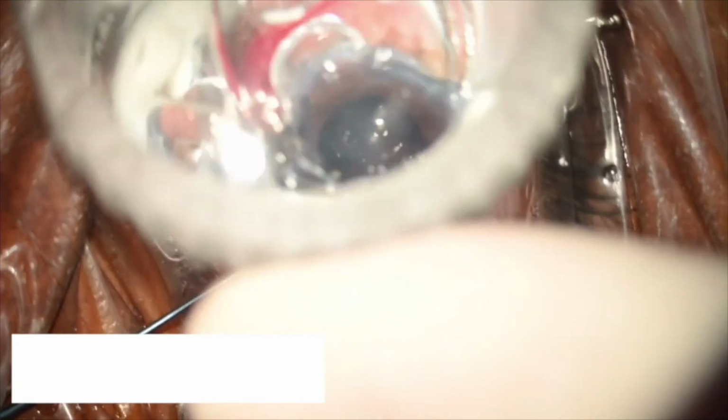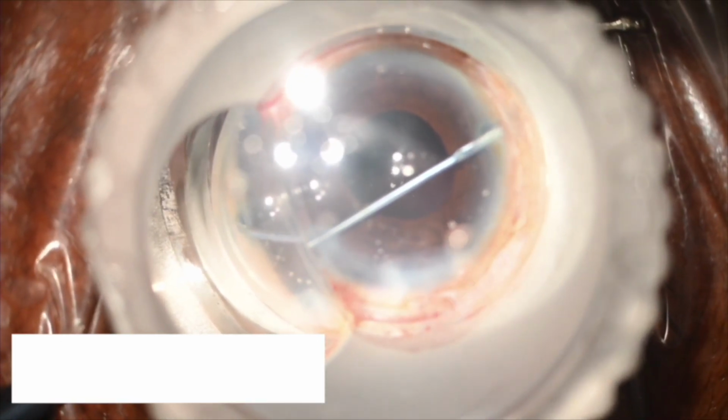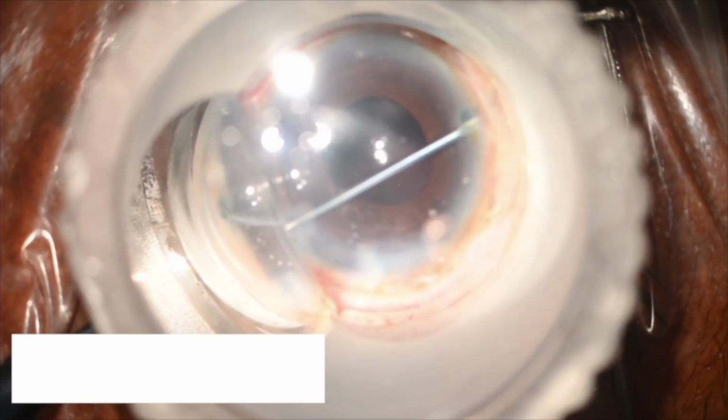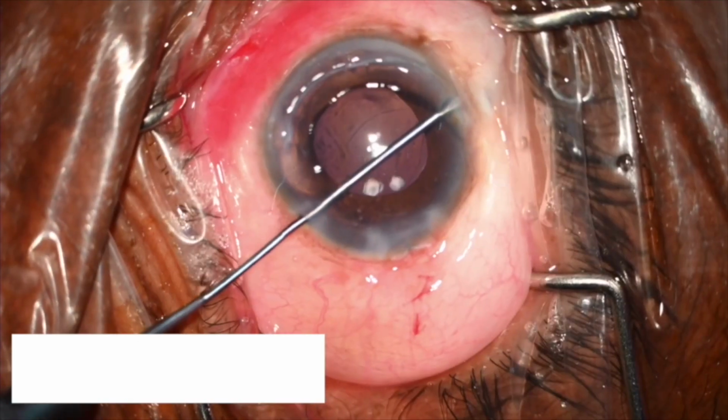A safer way of doing this is under direct visualization with a gonio lens. The Grover spatula is introduced through the ostium with direct visualization.